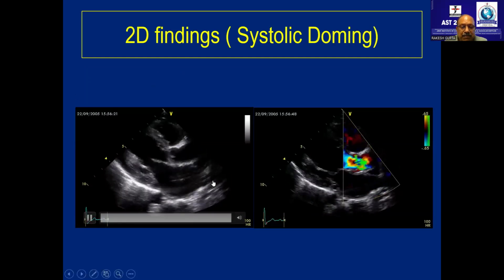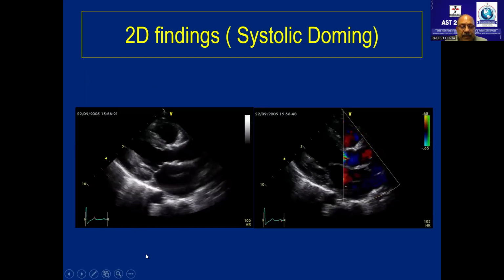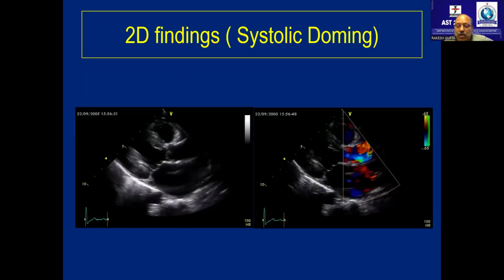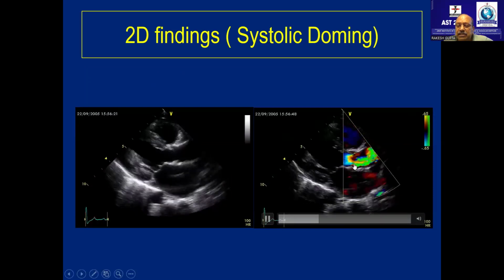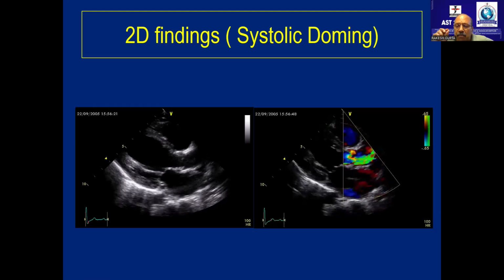Now look at this first finding. Look, this segment is doming in this patient. Look very carefully. It's doming. It's a dome. It's not like this, it's like this. And if you happen to have doming or stenosis, what will you find? You'll find turbulence. Look, the scale is 65. Normal scale, what we keep is 50 to 60. Even though the scale is high, I still have a lot of turbulence. What do you mean by turbulence? It means the orifice is small.